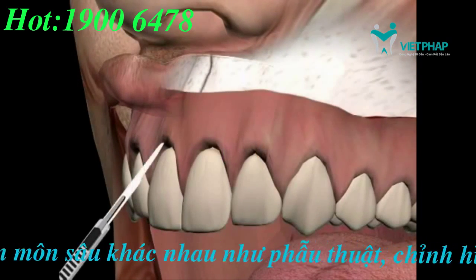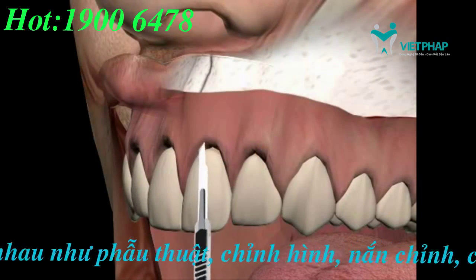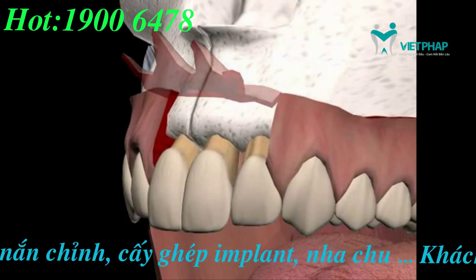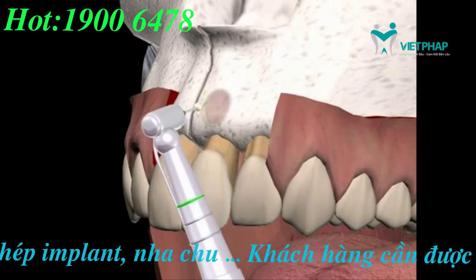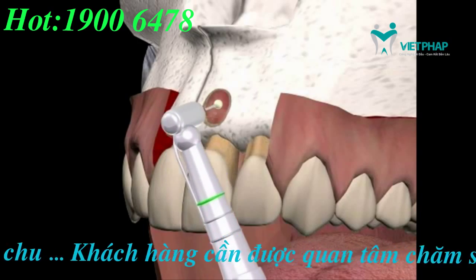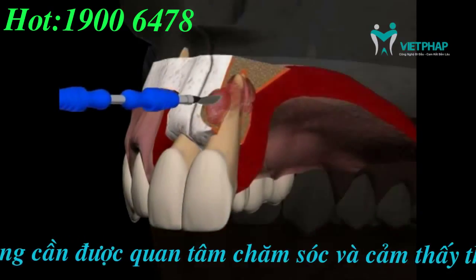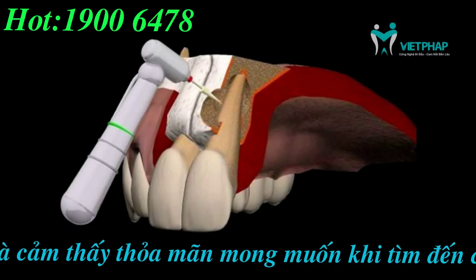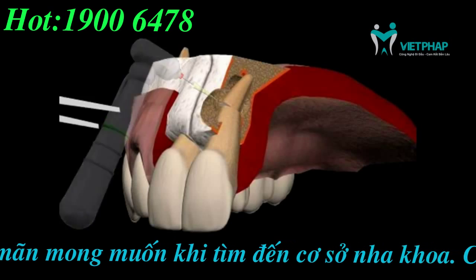Here, the tooth has already been opened from behind, and next follows the gum edge cut and the mucosa lobe preparation. Using a rose grinder, the bone is removed above the root tip, exposing the cyst. The cyst and the cyst content is cleaned out with a special spoon. Now the root tip is cut and removed.